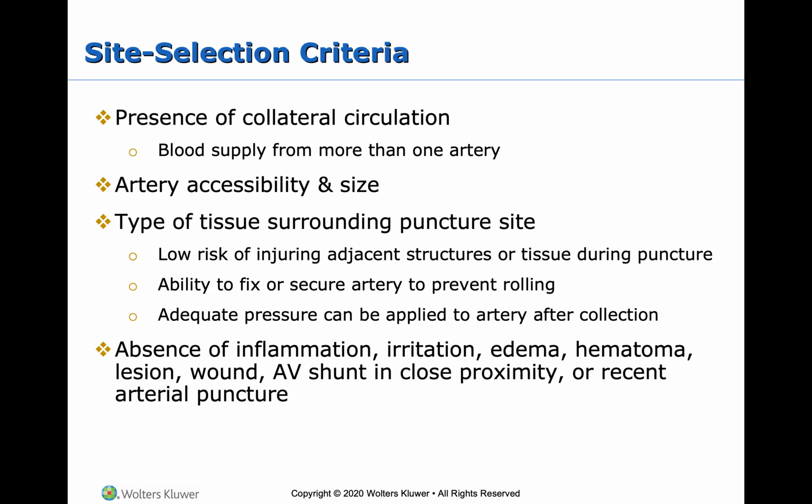That's where they access, like a port almost, where they access for dialysis purposes. So it's their lifeline, and it's highly susceptible to infection. So you're going to go to the other arm instead of the arm with the AV shunt or fistula.